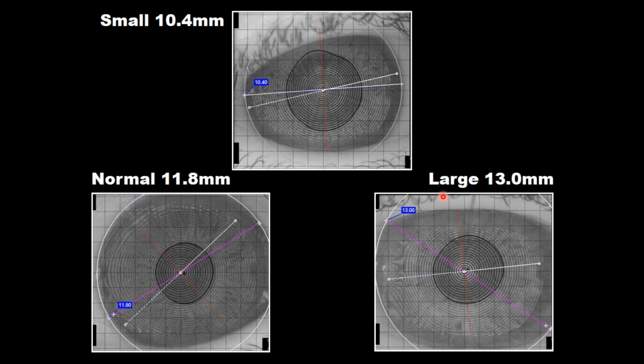I have to admit, at the school where I work at Pacific University, the CRT is the lens that we use most frequently, and to be honest, we don't look at visible iris diameter right off the bat as often as we should. Often, when things go wrong, it's something we refer to after and say, why didn't we pay attention to visible iris diameter to start?